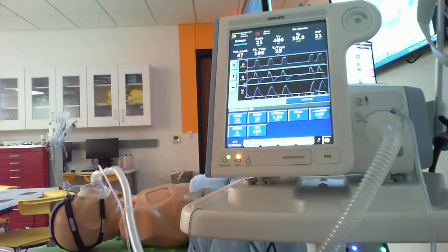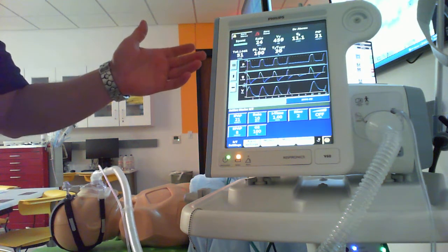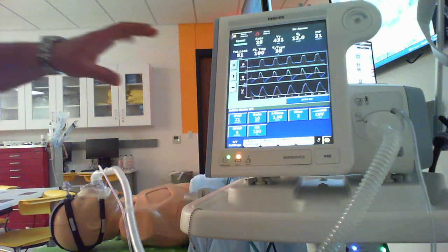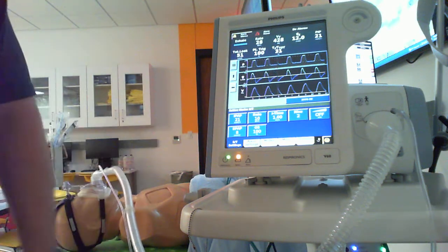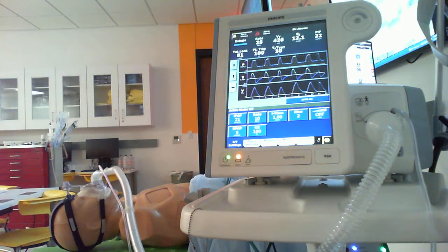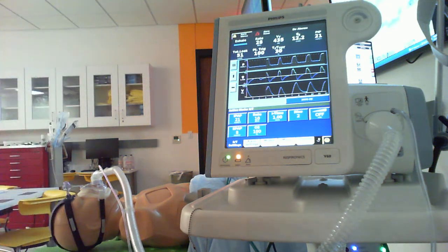I hope that video for initiation and initial titration helps, okay? You could do the same stuff as we move forward and get into making changes based upon blood gas. A lot of the same concepts still hold true, but to do our due diligence for our patient, we really want to try not to get fixated on, oh, I'm going to leave them on 10 and 5 and see what happens. We need to look at respiratory rate, tidal volume, work of breathing, look at that patient, talk to them in regard to making those setting changes, and give your patient an optimal chance for success from the get-go.